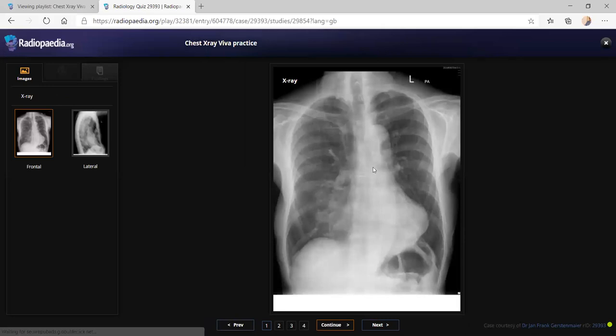So here, it's a 75-year-old male coming with back pain. This is a very good example for the hot seat. Actually, it will imitate right middle lobe consolidation. Usually you will wonder why the examiners keep showing us pectus excavatum in the exam. But you can avoid an unnecessary CT in a young patient coming with features of right middle lobe pneumonia. But you are not seeing the right cardiac border.